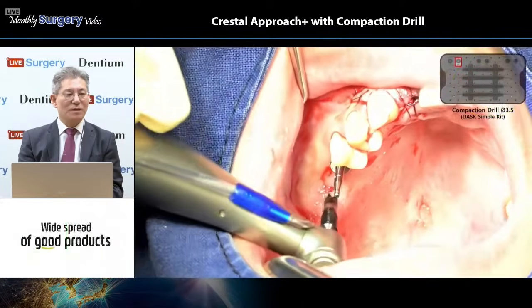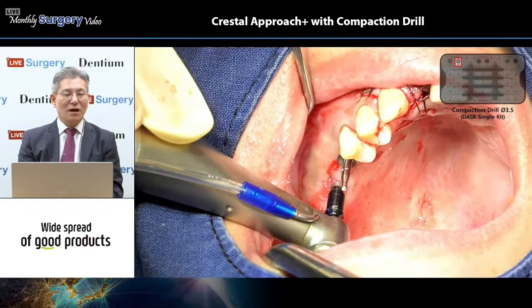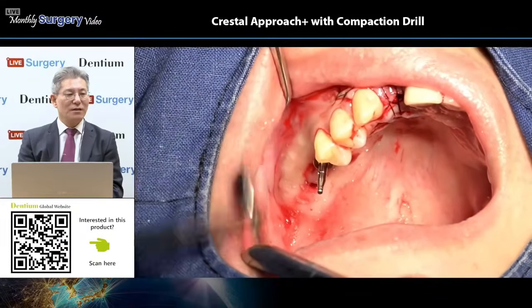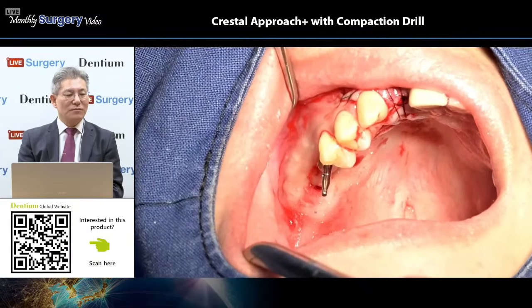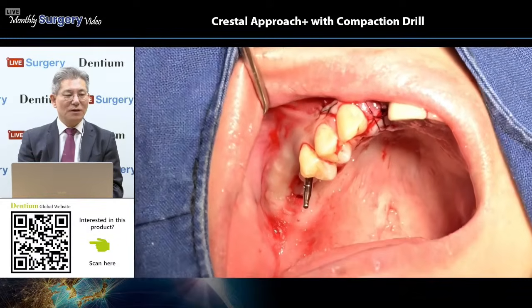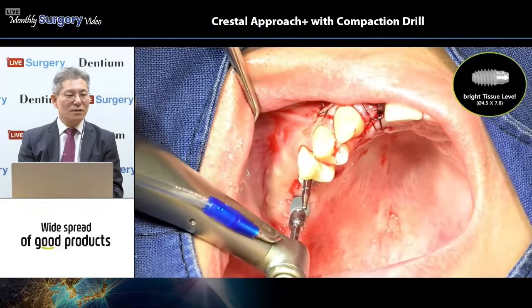I make small pieces from the cylinder type osteogenocollagen package, and then push the small particle pieces of osteogenocollagen each in turn.